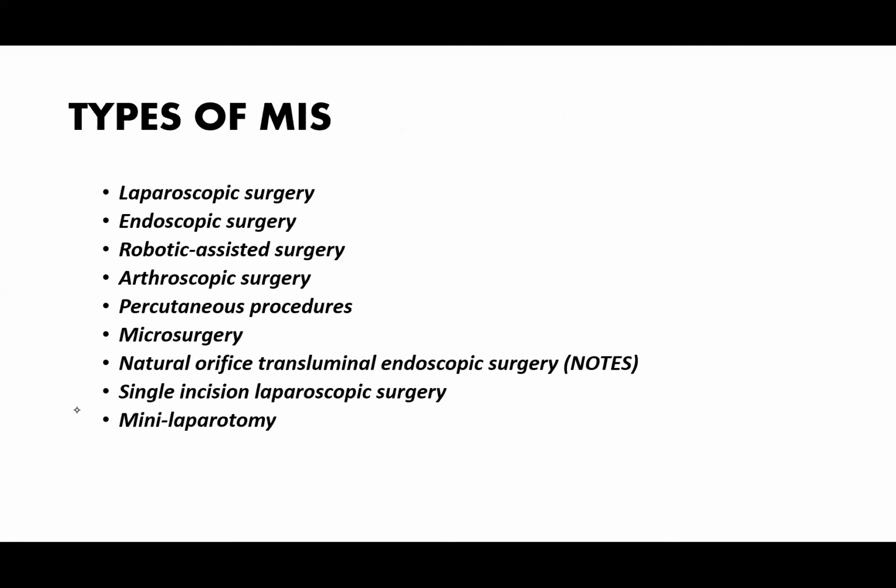So what are the types of minimal invasive surgery? Laparoscopic surgeries, which will be the bulk of our discussion and the aim of this basic course.